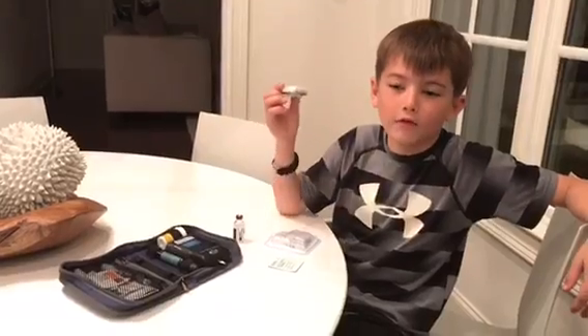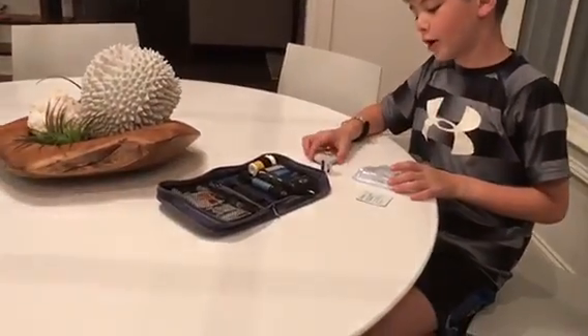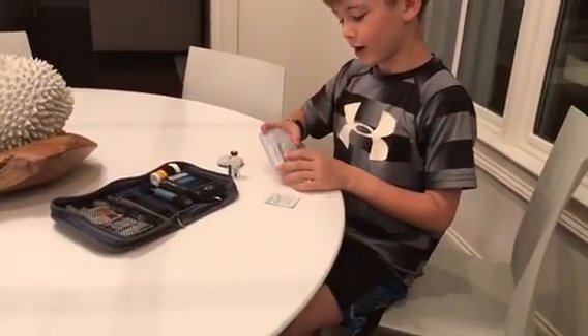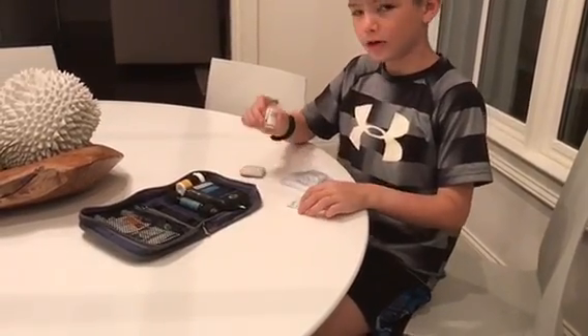Hello, I'm Bradley. Today I will be showing you how to change an Omnipod. I have already taken off my old pod. In order to put on a new one, I will need the syringe system, the new pod, an alcohol wipe, and some insulin.